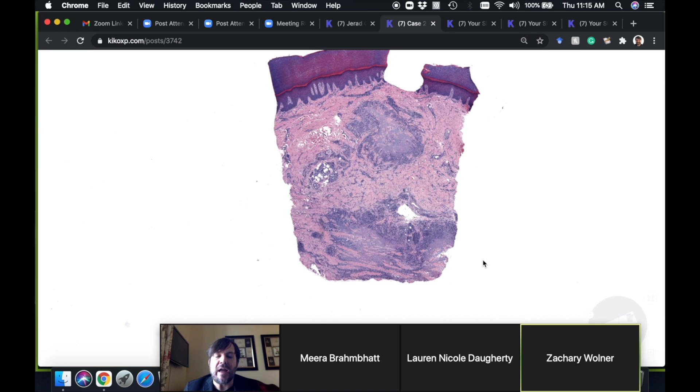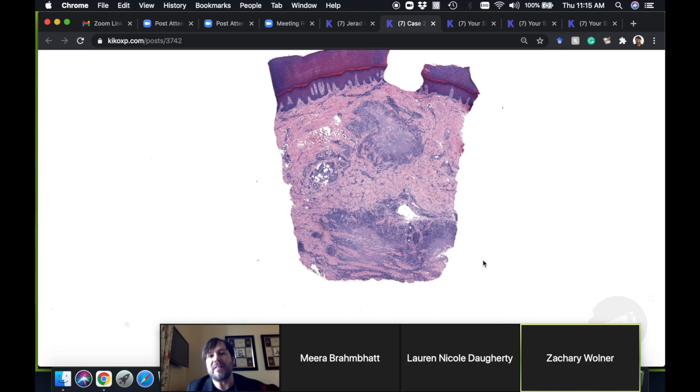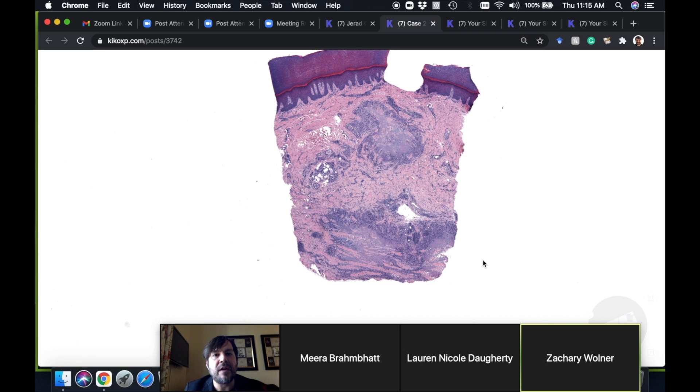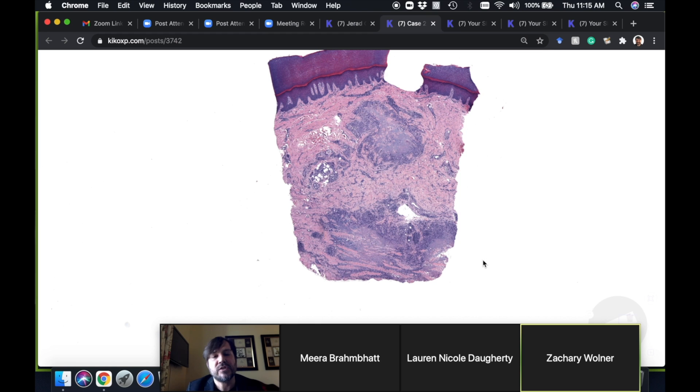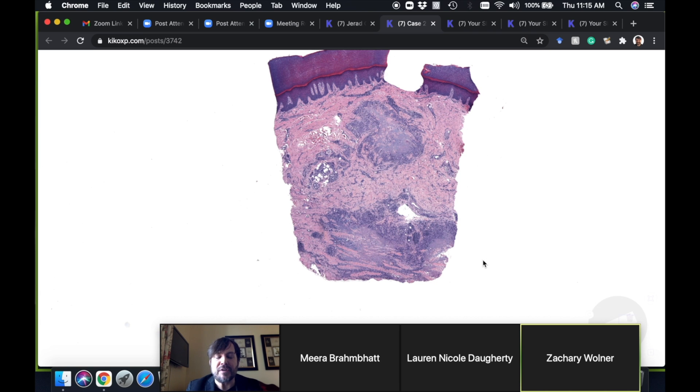They do tend to be deeper and because of that they can sometimes mimic a neoplastic process. If there's any doubt between rheumatoid nodule and granuloma annulare, I just put in my report palisaded necrobiotic granuloma and a comment that this could be granuloma annulare or rheumatoid nodule. Then the treating physician can inquire from the patient if they have a history of rheumatoid arthritis or do some serology.